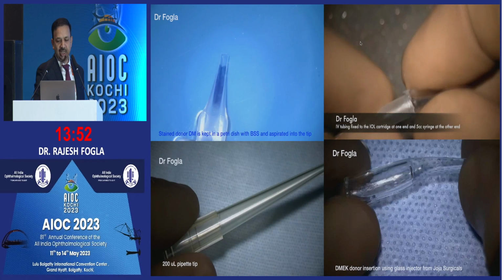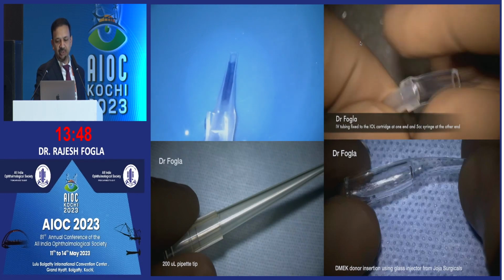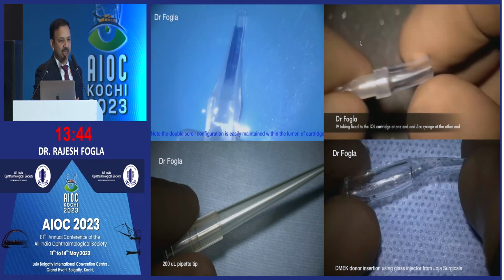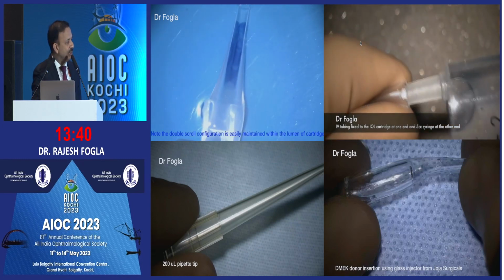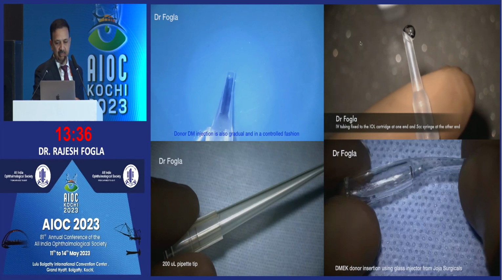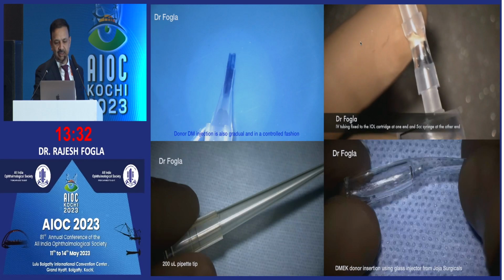One end attaches to the tip of the cartridge and the other end you can attach to your syringe. You can decide the length of the tubing. I don't like to keep it very long because then your donor insertion becomes a two-handed technique. But if you keep the tubing part a little smaller, then you hold the injector as a single.